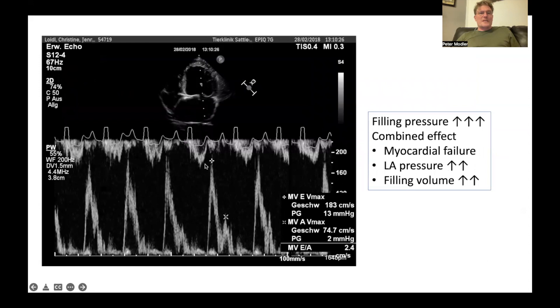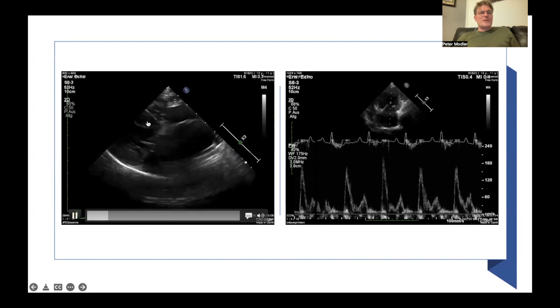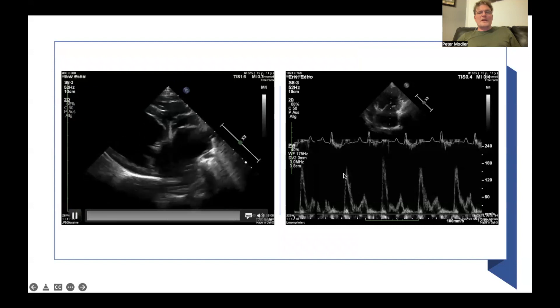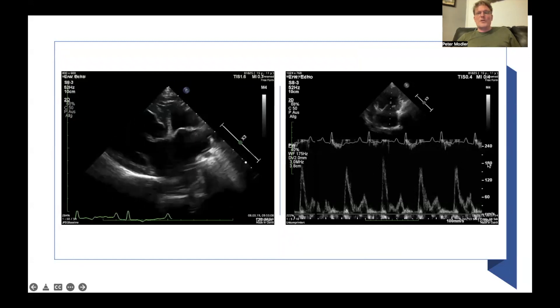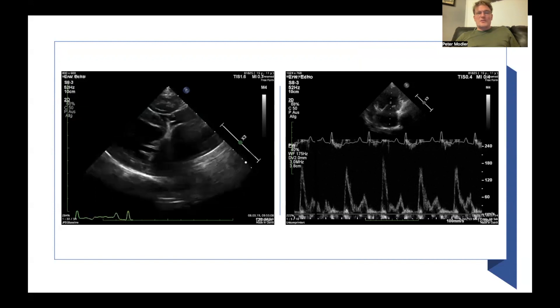Looking at a patient with very advanced mitral valve disease — a huge left atrium and huge left ventricle — with the PW Doppler sample volume correctly placed, you see a giant E wave at 1.8 meters per second. This is a consequence of high left atrial pressure, high filling volume, and possibly some myocardial failure as well. Another dog with left ventricular volume overload and an enlarged left atrium also shows an E wave of around 1.8 meters per second, making it quite realistic that this patient is already in congestive heart failure.